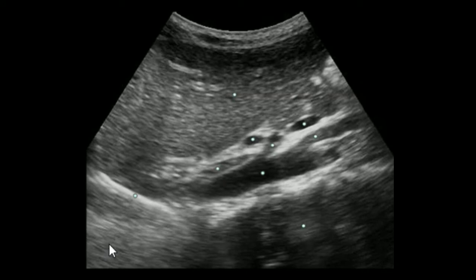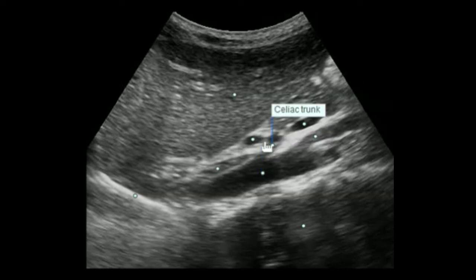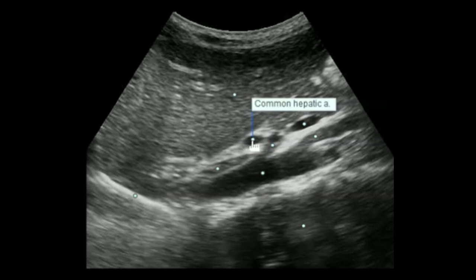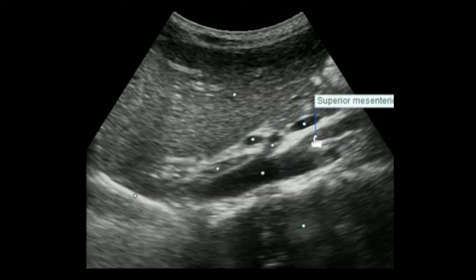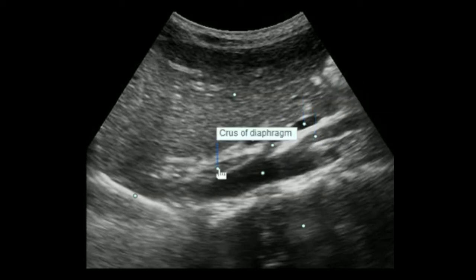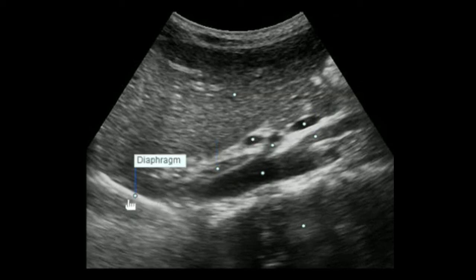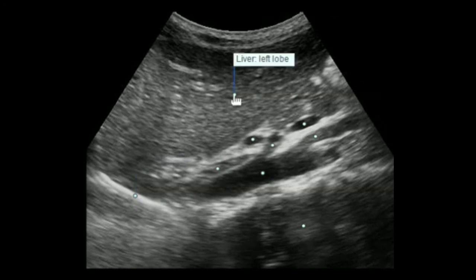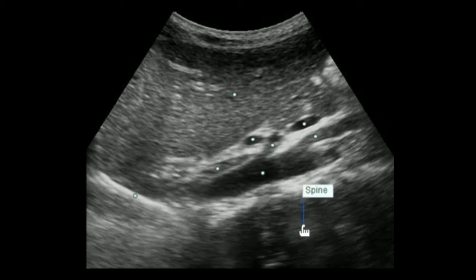This is a longitudinal section. Here we can appreciate the aorta, the celiac trunk with the common hepatic artery as a branch, and the splenic artery. This is the SMA. Once again, the crus of the diaphragm is visualized. This is the diaphragm, while this is the left lobe of the liver. Posteriorly, the spine is visualized with posterior acoustic shadowing.